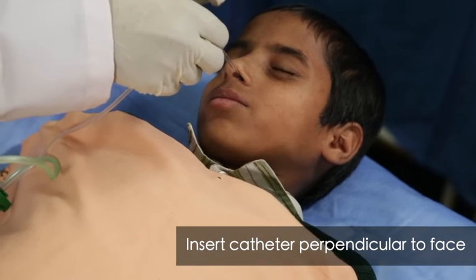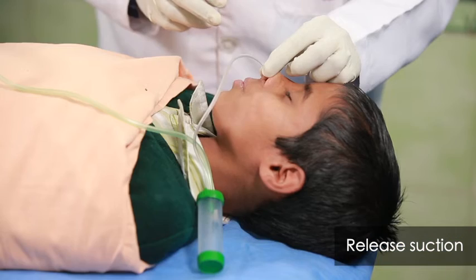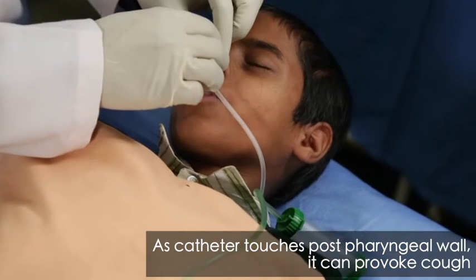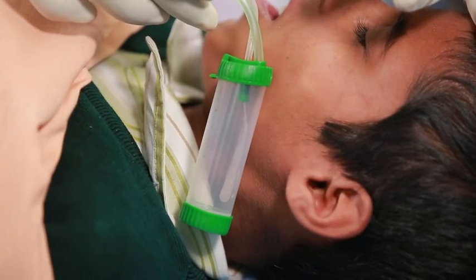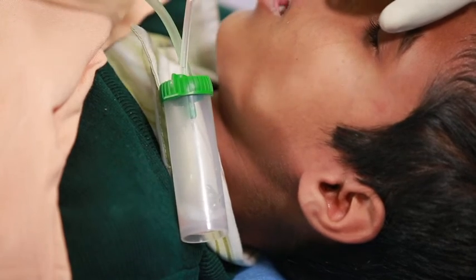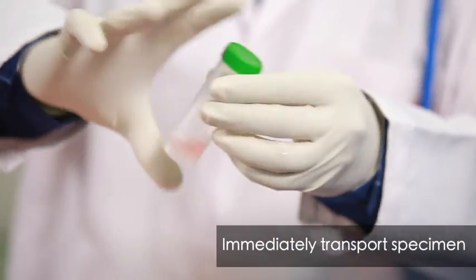The catheter is gently inserted into the nose in a direction perpendicular to the face. Release suction. As the catheter touches the posterior pharyngeal wall, it can provoke cough. The loosened secretions are brought up with the cough and suction will facilitate its collection in mucus extractor or suction trap. In this child, as you can see, respiratory secretions have been collected. This should be immediately transported to Gene Expert lab.